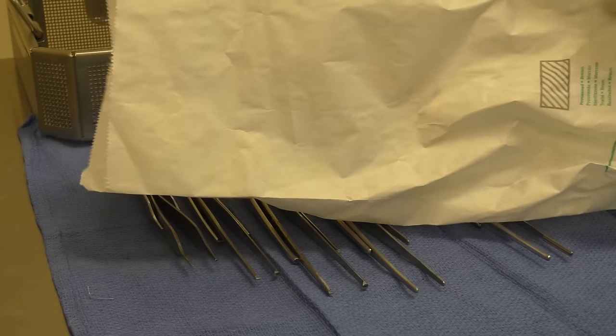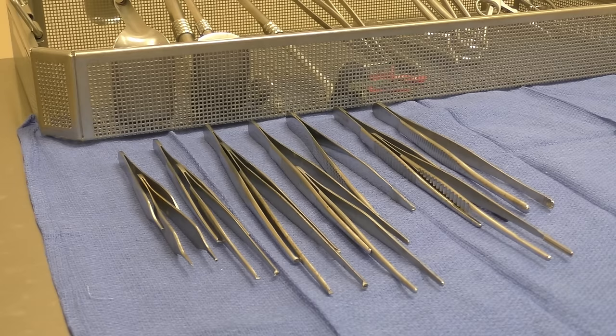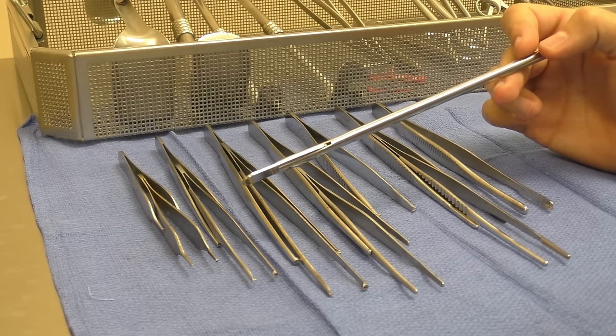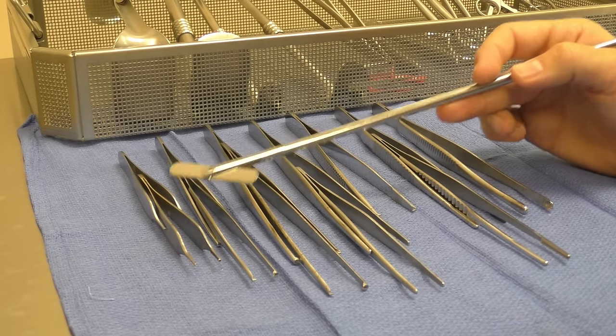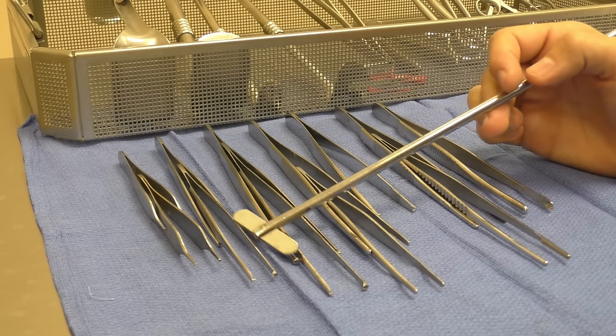All right, the last part of this tray is everything that you'll get kind of in a bag similar to this. It's basically all of your loose items, which are gonna be your forceps and your knife handles like that. All right, so breaking these forceps down, these are very basic because again, this is a minor general tray. These are the Adsons with teeth up front here, obviously used for skin, so that's why I have them right here. And we have the tissue forceps here.